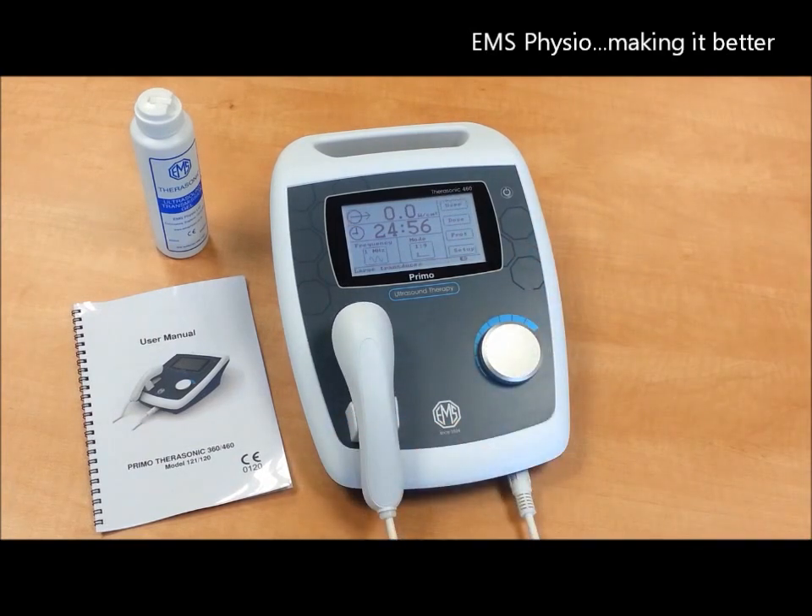If you prefer, the devices come in several pre-programmed languages including French and Turkish. Please see your country dealer for specific details.